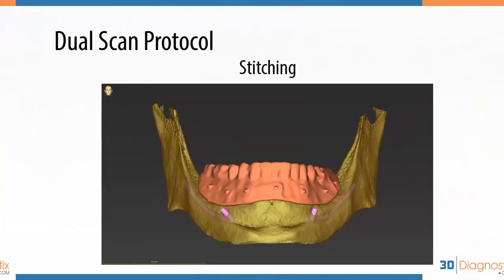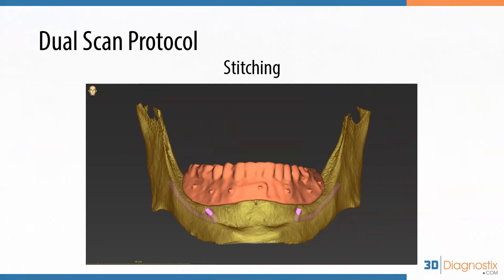Once we're done, we take those DICOM data, import them into the software, and stitch both scans together into one. This is how the final result looks — you can see the patient's arch and also the denture in place. We use those radiographic markers to stitch the scans together.